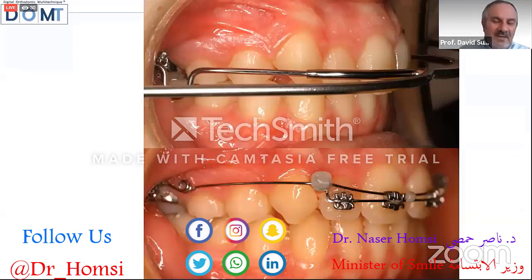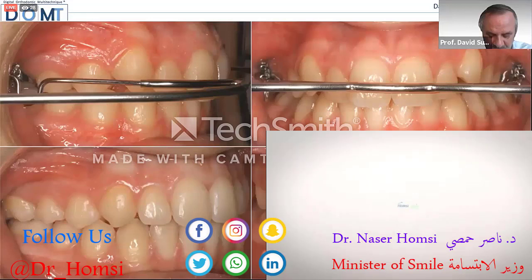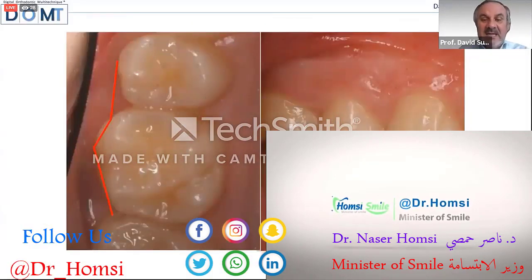Okay, I like very simple treatment. Headgear is not a very popular treatment in our office because the patient and the parents hate the headgear. But headgear is a very, very good treatment in the maxillary class 2. Why? Because it's very cheap, produces an expansion effect, a distalization effect, a rotation effect, and an increase of the vertical effect, and this produces a lot of advantages. For this reason, I like it very much.